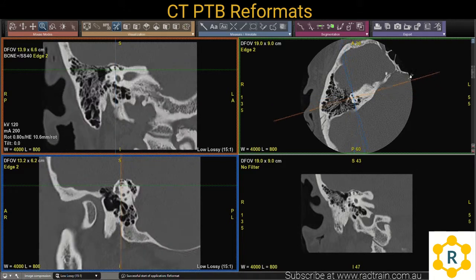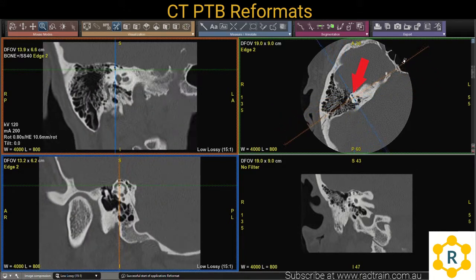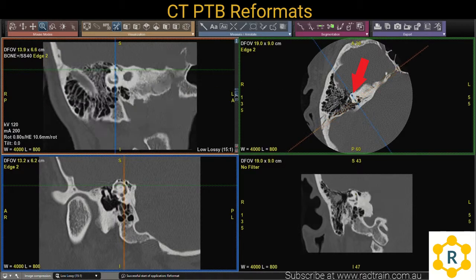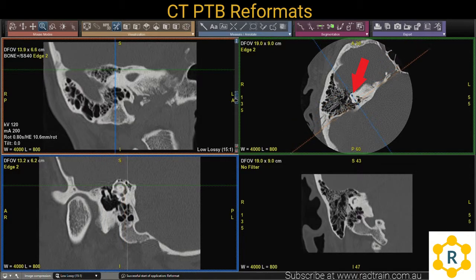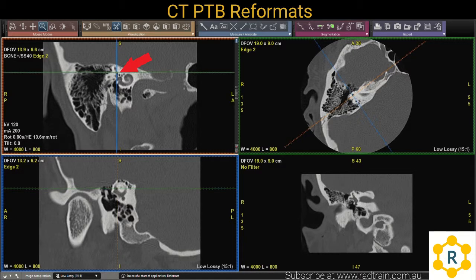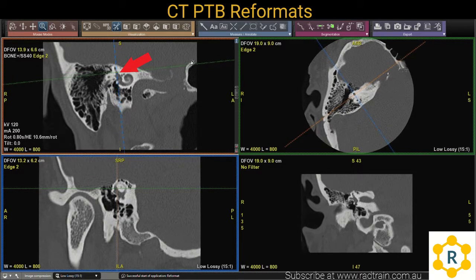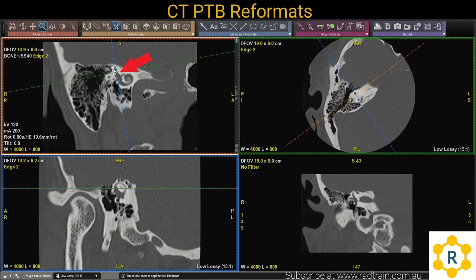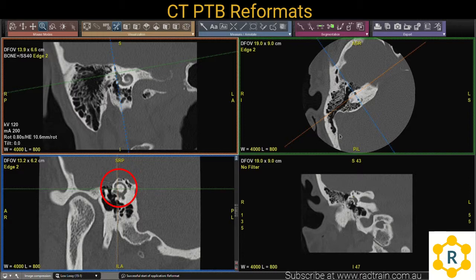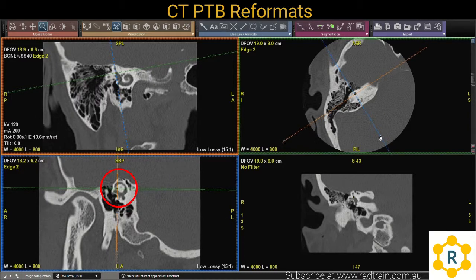To start with, get the superior semicircular canal on the axial plane and drag your oblique line parallel to that, which I have done with the blue line. That's only half of the battle. What you need to do then is find the 90 degree plane to that, also find your superior semicircular canal, and drag the plane parallel to that as well, which I have done with that blue line. What you should get in the bottom view is a nice complete ring of the semicircular canal.